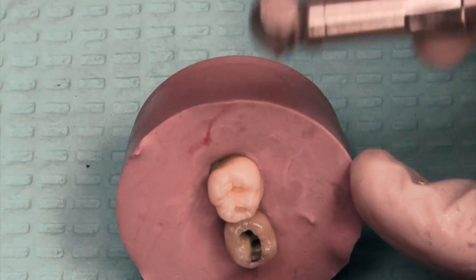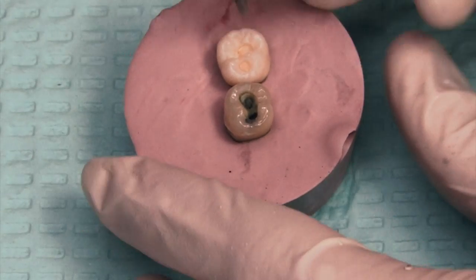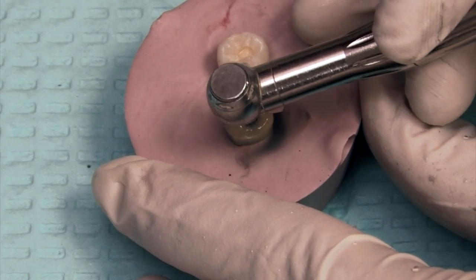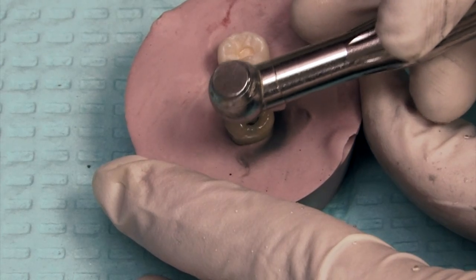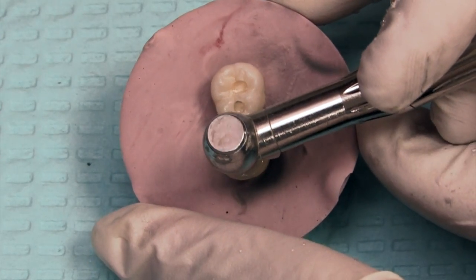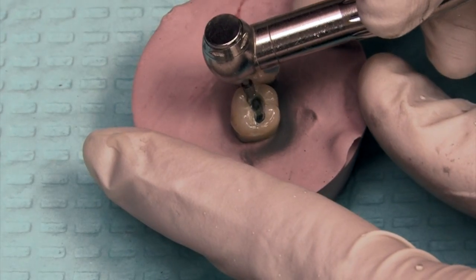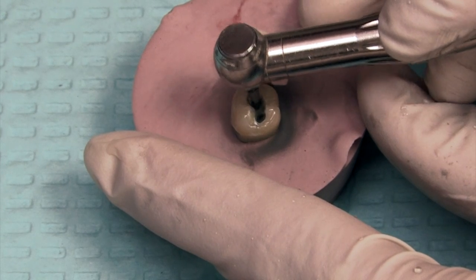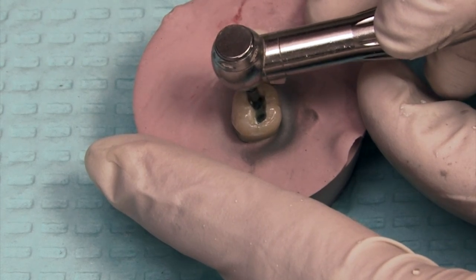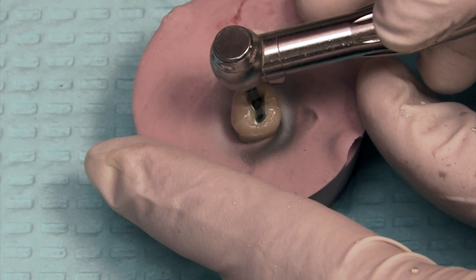Now I've rinsed off that tooth and I'm going to evaluate it. There's still a little bit of silver filling left. I didn't see it because it wasn't being blown away with water and air like it would be normally in a clinical setting. Going around and prepping, I'm just going to go around the edges to make sure that all the walls are nice and smooth. The shape of this bur is going to result in a divergent prep. Since this is going to be composite and it's bonded, whether it's convergent or divergent is less of an issue than if it was amalgam.